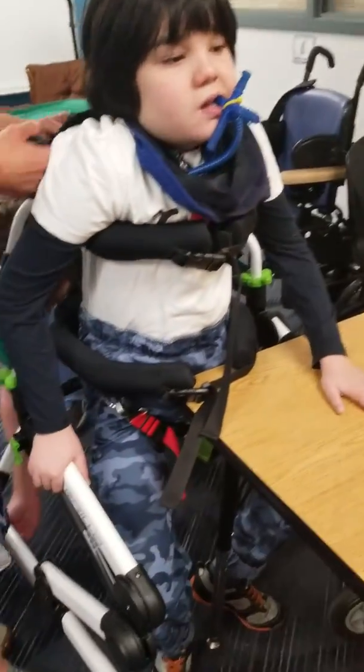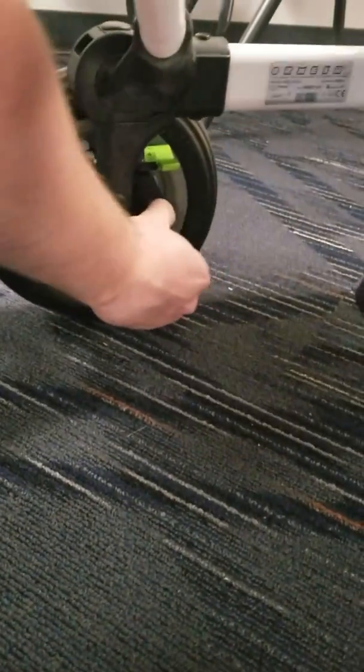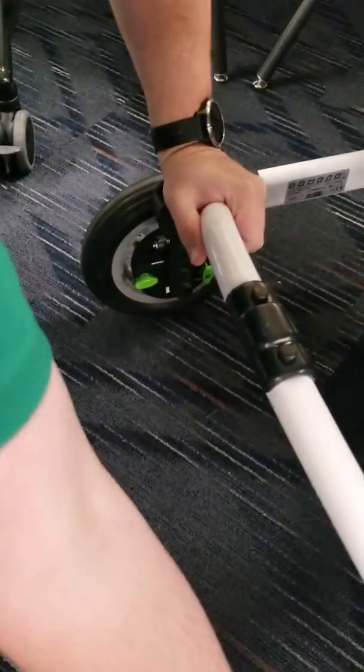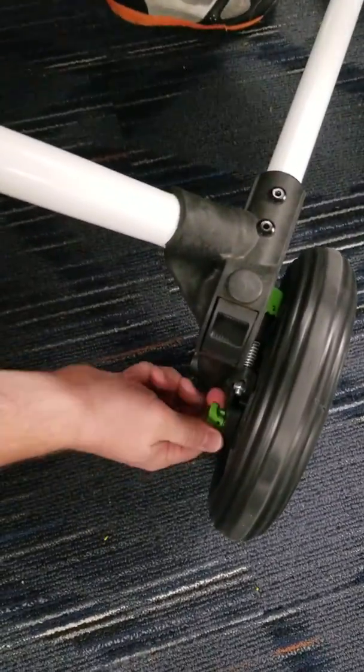So then what we'll do is if we're stopped at a table, we'll do these middle brakes because the middle ones are the complete stop brake. So the middle of the three, these green ones right here, which you have to pull out to get them, and then he will not move. These are the back ones, so you can only go forward, not backward.